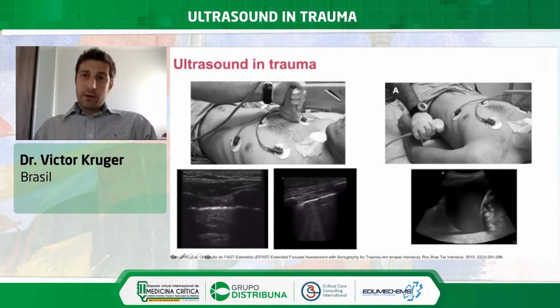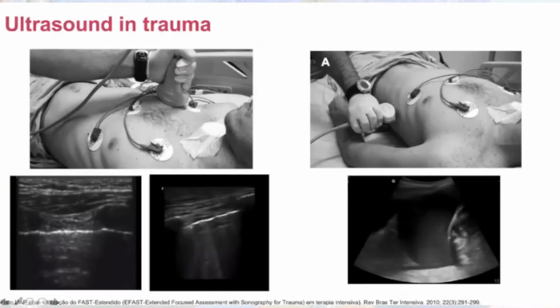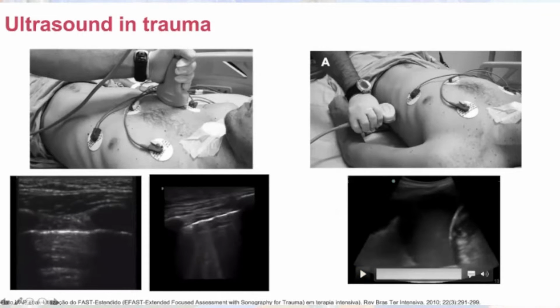When you look posterior at the axillary midline, the recess, we're seeking fluid in the chest cavity, fluid in chest cavity in trauma, hemothorax. And here you can see a large amount of fluid, and here the diaphragm. Diagnosis, hemothorax.